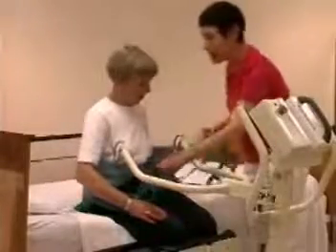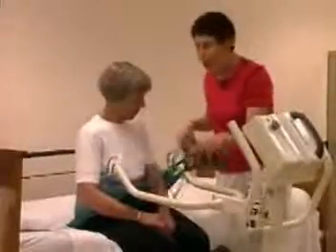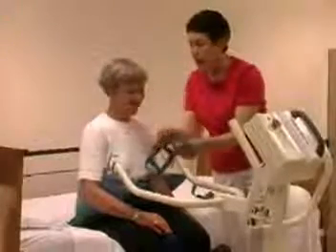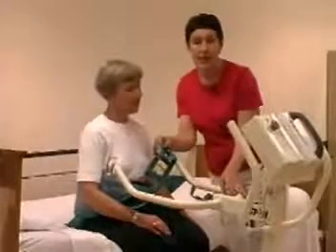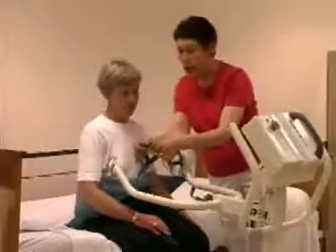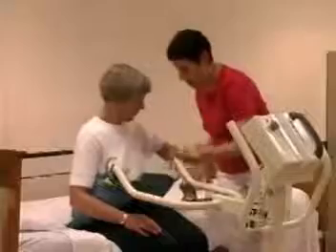Now I'm going to place the ends of the sling into the loop holders. What I want to do is put them through the loops that will allow me to have Mrs. Johnson as close or as far away from the lift that she needs to be. I'm going to choose the yellow and purple loops to put this through.